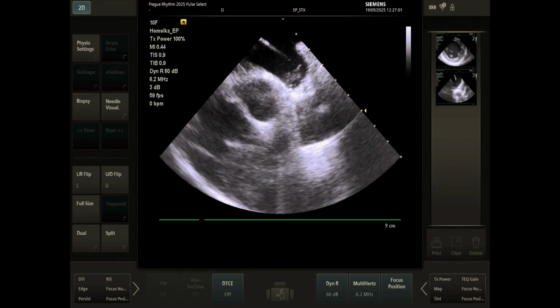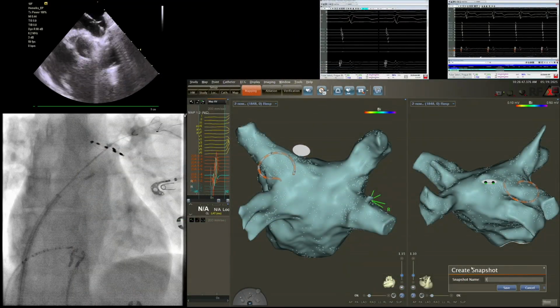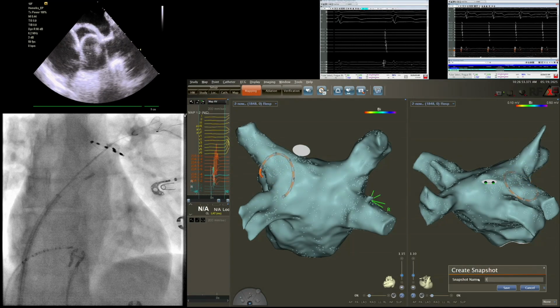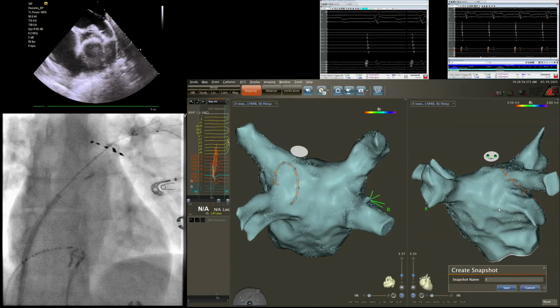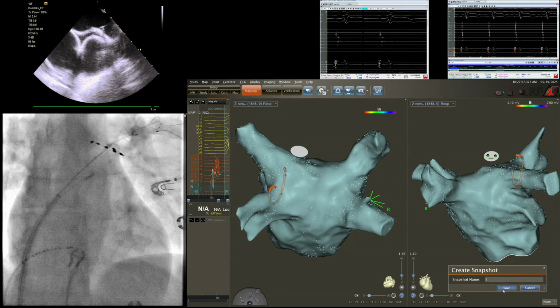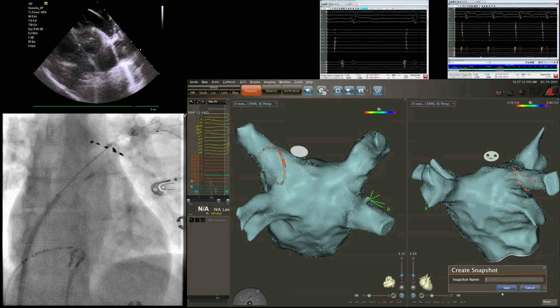And you can see the visualization on the catheter, okay? So we are a little bit more inside of the vein than we need to be. But actually, I think we can start even a little bit deeper, because it's pulsed field. We can prove that we have no risk for PV stenosis. So usually the strategy with this 1,500 volt pulse, we are pulsing 4 cycles, synchronized on the QRS, and usually we do like 2 applications per position.